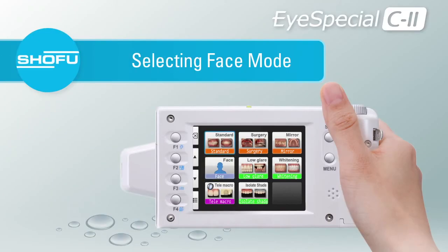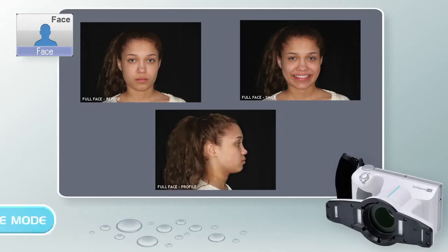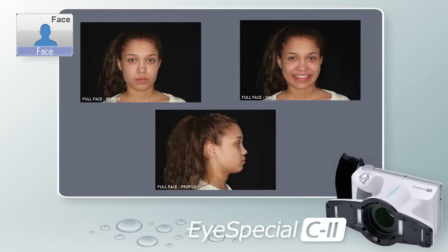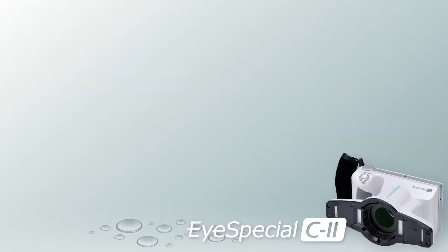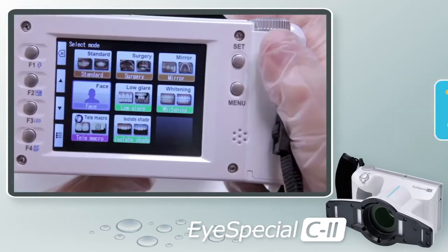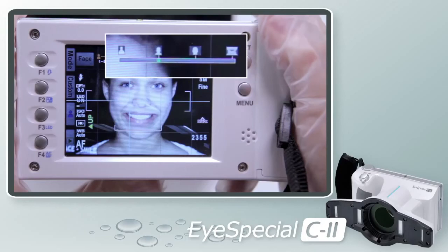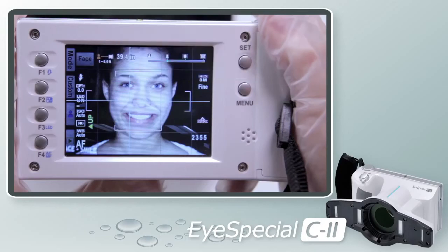Selecting Face Mode. Face Mode will be used frequently when doing cosmetic dentistry or orthodontics. The most common series of photos taken in Face Mode are Full Face Repose, Smile, and Profile. Selecting an appropriate background is very important — a black or dark blue background works best with the patient standing about one foot away from the background. Face and profile shots are a requirement for cosmetic and orthodontic case planning, and the iSpecial C2 is the ultimate dental tool to achieve great results. Press F1 or Mode, then select Face Mode. In the top right corner, you will see icons with various magnification ranges unique to this mode.